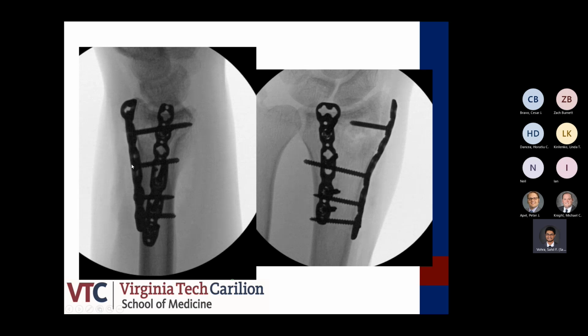And then I think we had placed this screw first to compress the plate in and hold everything. We didn't really need these more distal screws because the force of the plate was actually holding that reduction there. And then for that transverse radial styloid component, we added this radial column plate to help prevent that from shearing. Sahil, that looks beautiful.